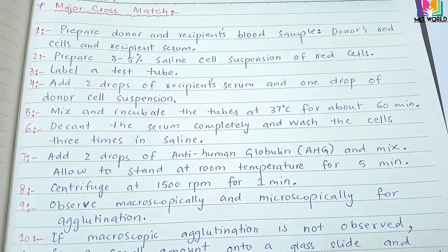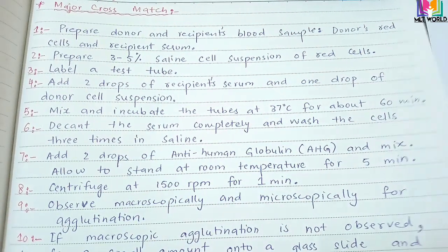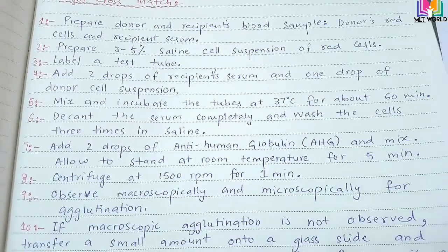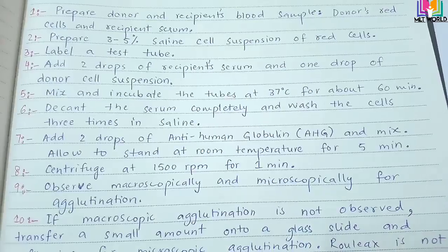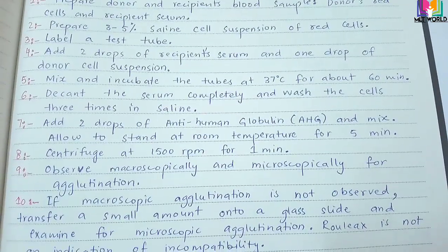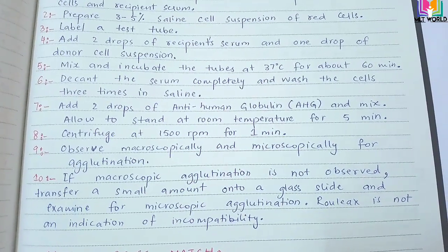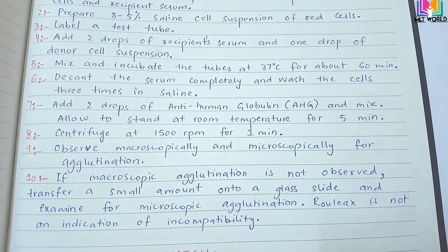Now when you see under the microscope that there is rouleaux formation, rouleaux of red cells, do not consider rouleaux red cells as agglutination. Rouleaux RBCs doesn't mean agglutination. Only if you see visible agglutination, clumps, as I already made one video on how agglutination is seen under the microscope, that you can watch.